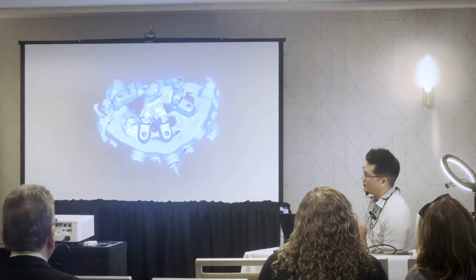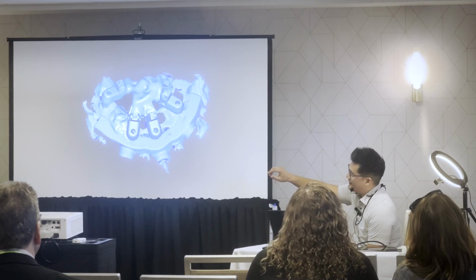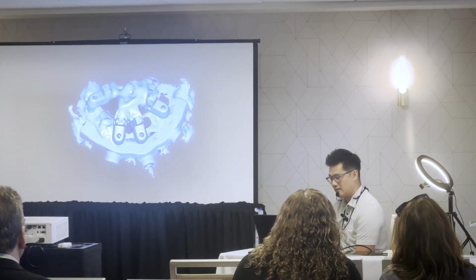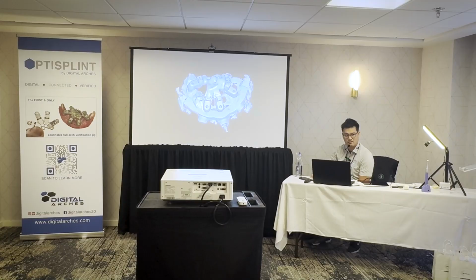I'll show you a different workflow, but in this particular case, we scanned it in the mouth. And then we scanned it and we capture the bone reduction guide with it. That's our registration point. So there's nothing more that surgeons hate than leaving teeth for a reduction. Meaning if you're doing a mandibular case and you don't use bone screws or some sort of registration screw, and you say, oh, hey, I leave these teeth in, surgeons hate that. So you don't do that.